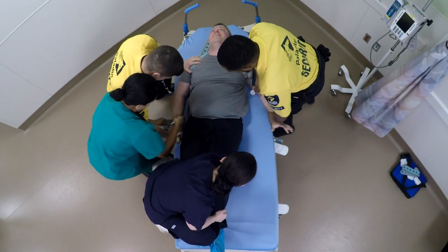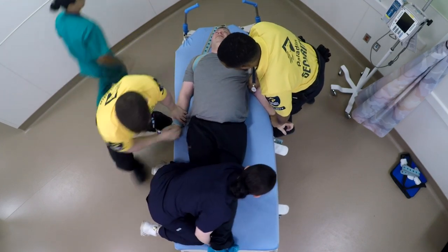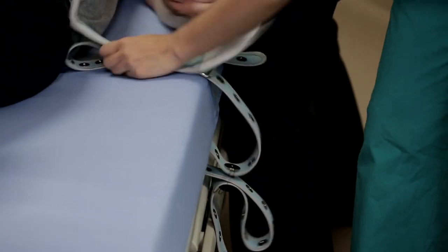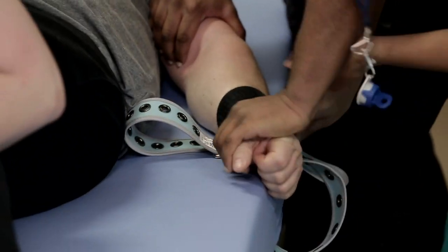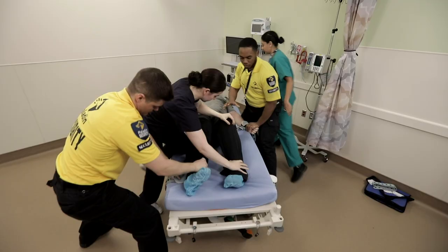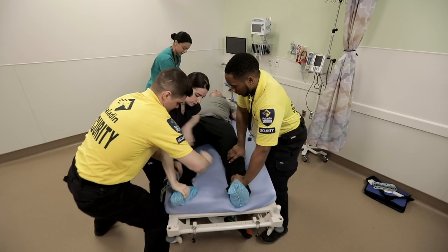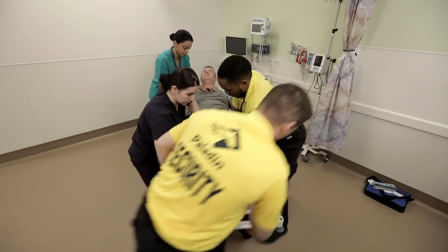Unlike traditional restraints, the wrist does not need to be forced into a fixed cuff. The wrist can be easily entrapped by the one-way butterfly Velcro cuff while the limb is still moving. Once one arm is secured, both team members proceed to the other limbs and assist in securing the other arm and then both legs.